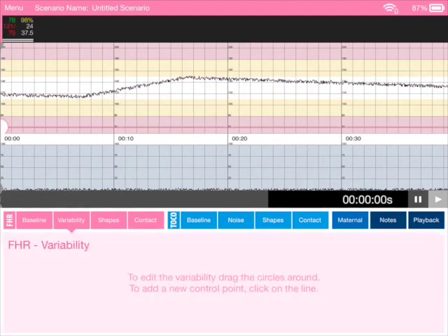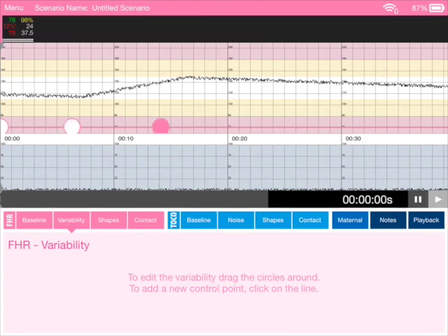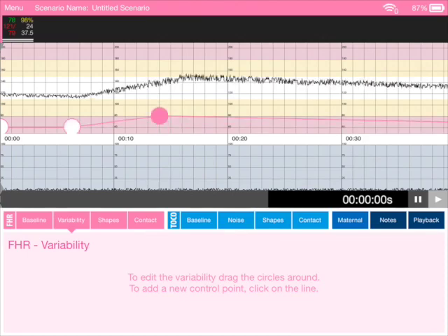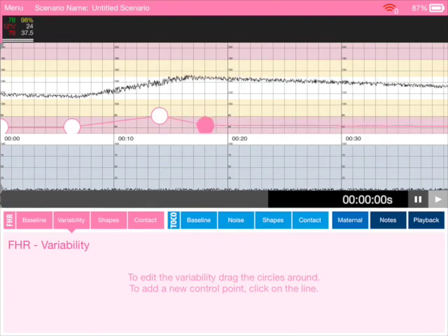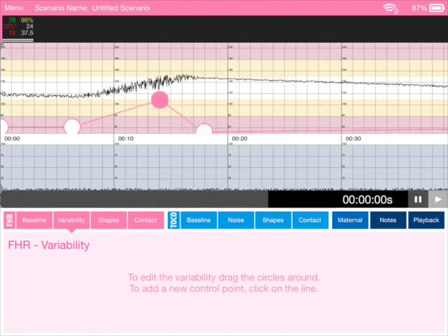We can alter the variability of the fetal heart rate line. We'll just add some dots there and we can alter the variability really simply by just moving those dots around.